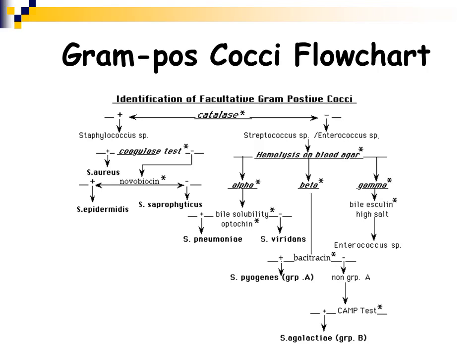Here's a nice flow chart for your gram-positive cocci. So we showed a flow chart at the end of the Staphylococcus lecture for the catalase positive staphs, and there on the left hand side you can see the Staphylococcus. This one is not quite as extensive, but it still gives you the idea. You have a patient sample, you have a gram-positive cocci, you do your catalase test.